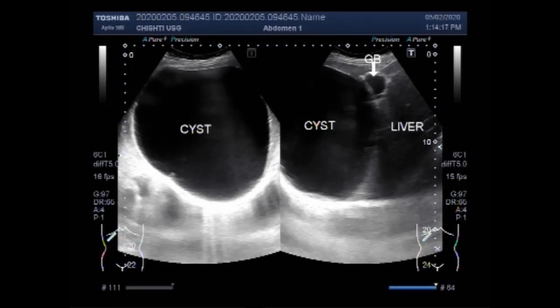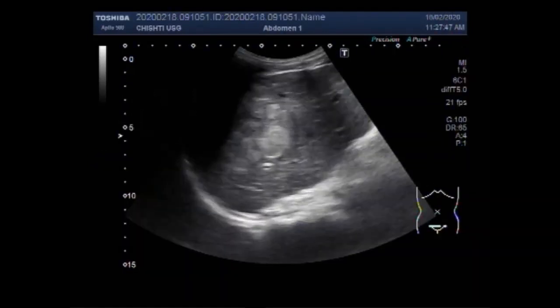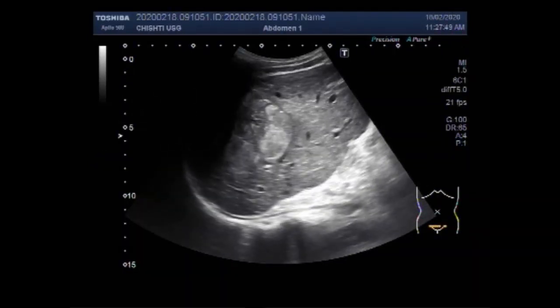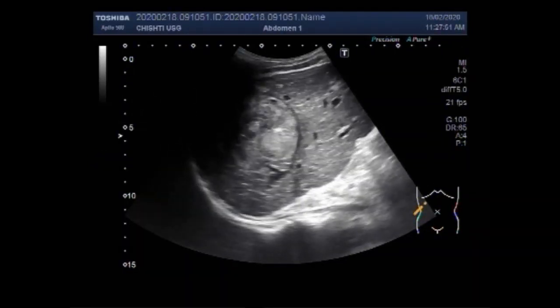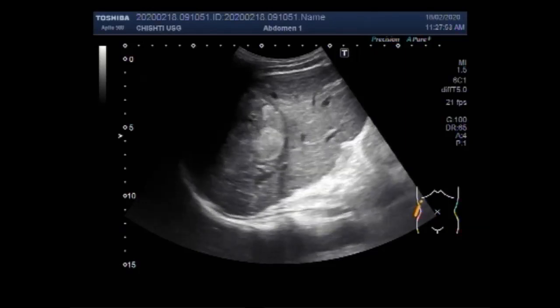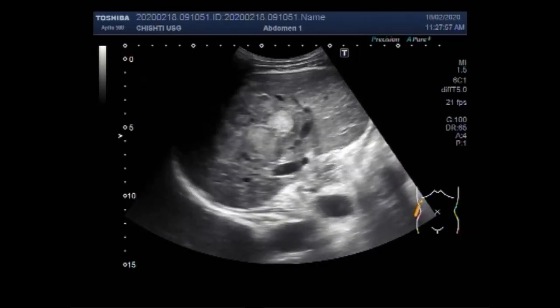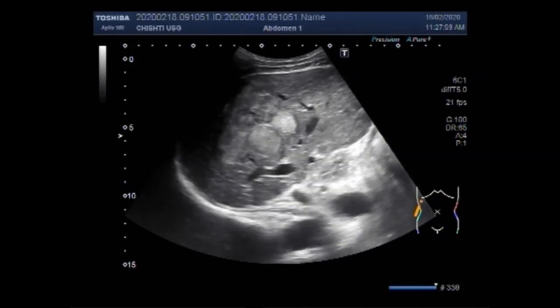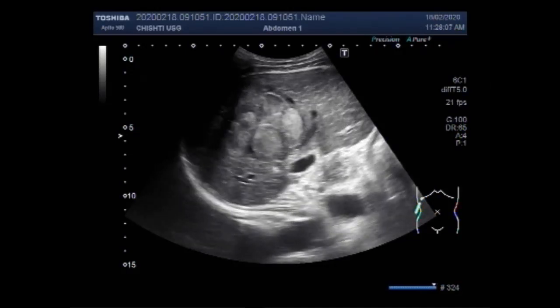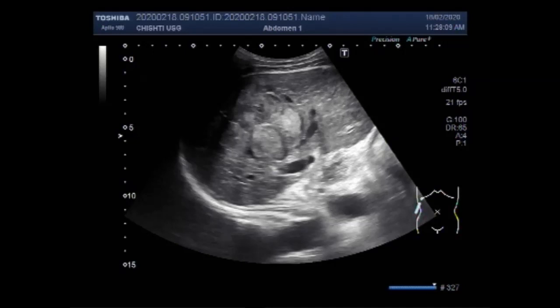Now you are going to see the second video. You can see a large mass in the liver, in the central portion, appearing to lie in between the right and left lobes of the liver. This is a semi-solid to solid mass.